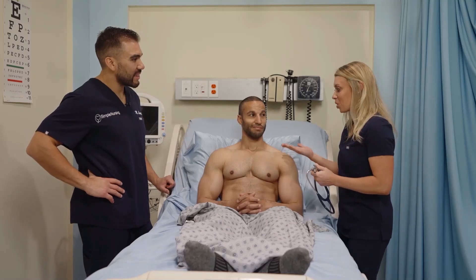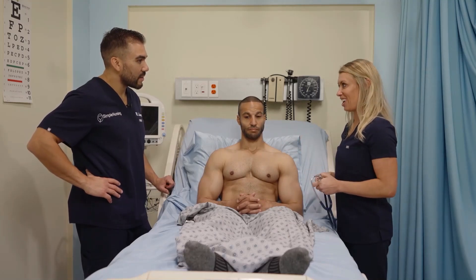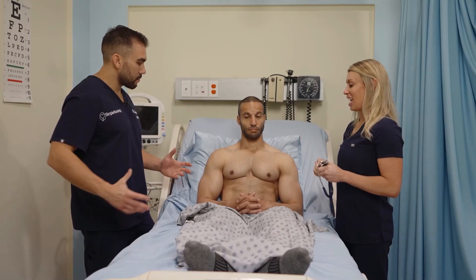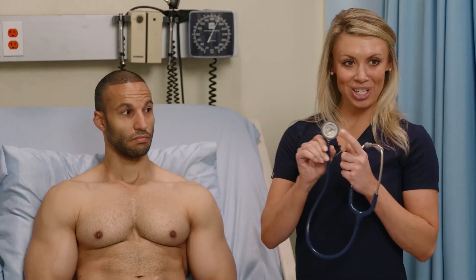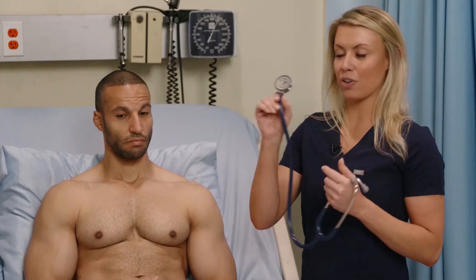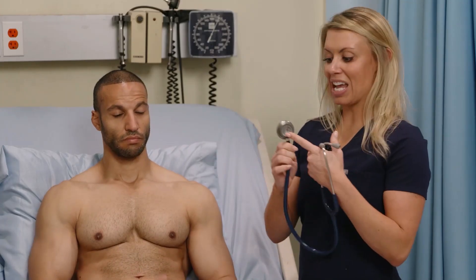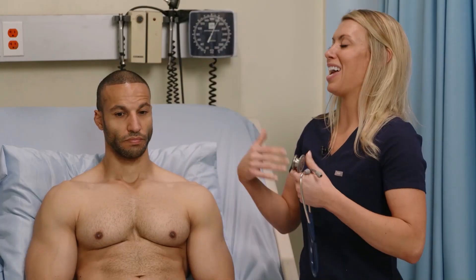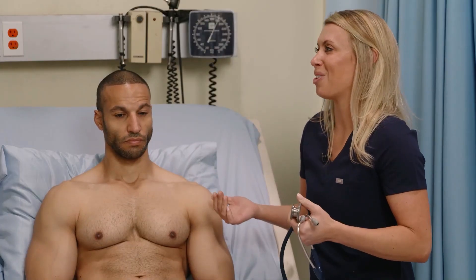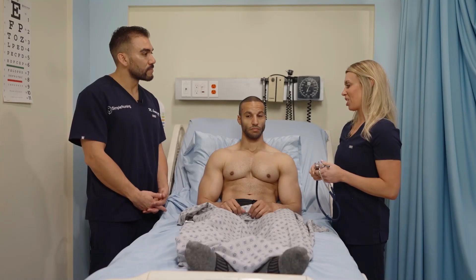The next thing we would do is go to our five cardiac areas and listen to each of those first with our diaphragm, listening for our normal heart sounds, and then the second time with our bell, listening for those extra heart sounds or any murmurs that would be occurring.